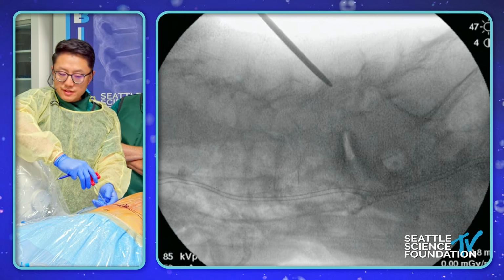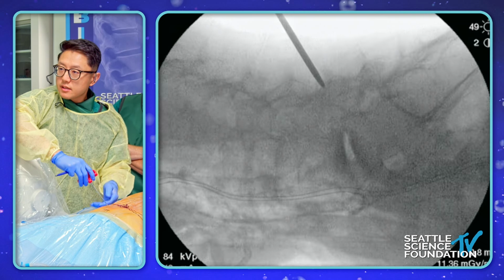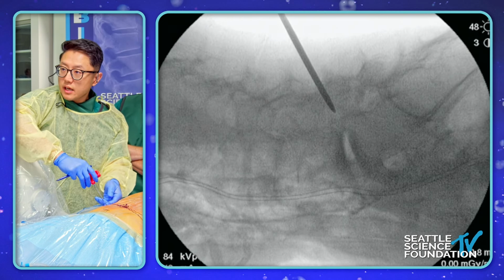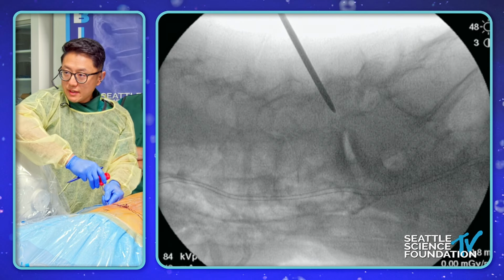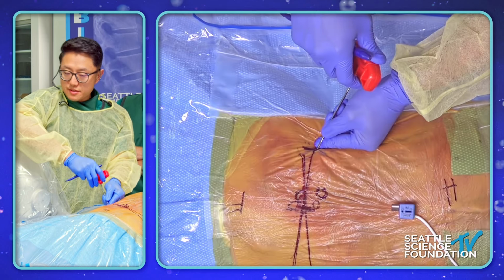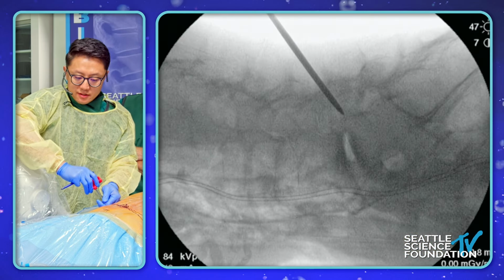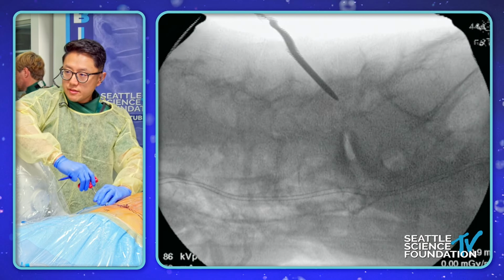Okay, so I'm on the facet joint. Shot there. Okay, I'm going to slide off. Let's see a shot there. And that feels like I've slid off into the foramen, although this image is really hard to tell because of the rotation and we can't turn the bed. Shot there. Okay, so I'm going to assume that that's the facet joint. One more shot there. Feels like it.